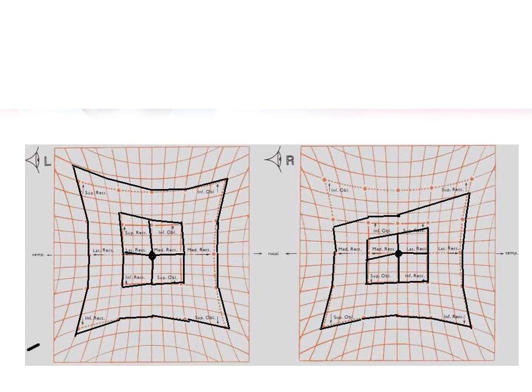As we previously mentioned, the right eye is the eye with the primary pathology, as it has a smaller field. There is limitation of elevation of the right eye in adduction, consistent with an inferior oblique deficit. The cause of this limitation is a restrictive lesion for two reasons. First, there is no overaction of the direct antagonist muscle, which is the superior oblique, and this causes a compressed field.